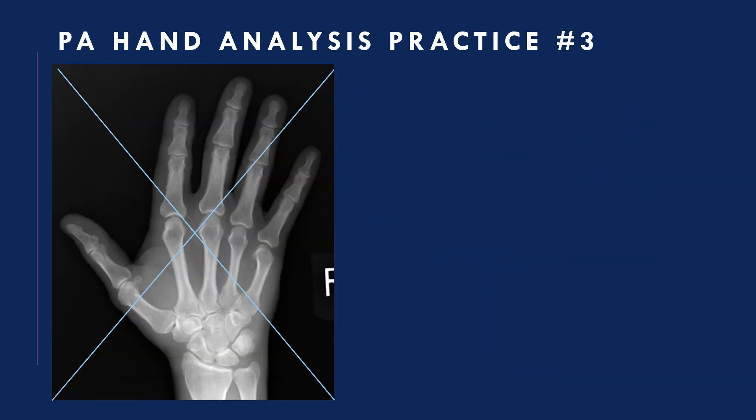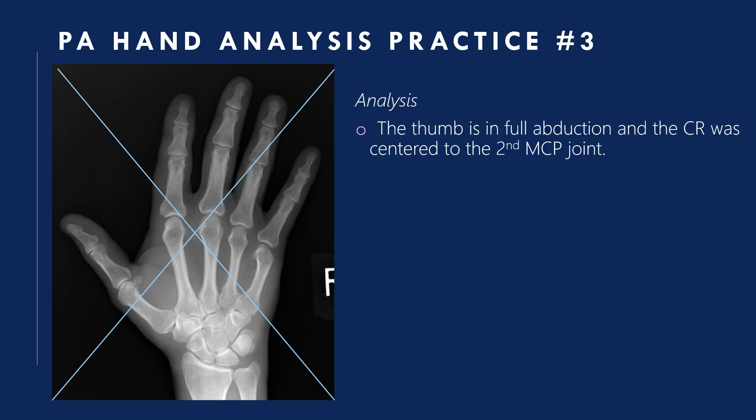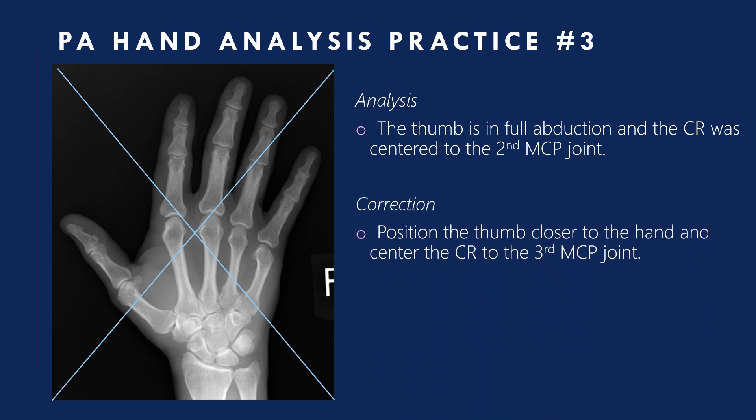PA hand analysis practice three: the thumb is in full abduction and the CR was centered to the second metacarpophalangeal joint. Correction: position the thumb closer to the hand and center to the third metacarpal joint.